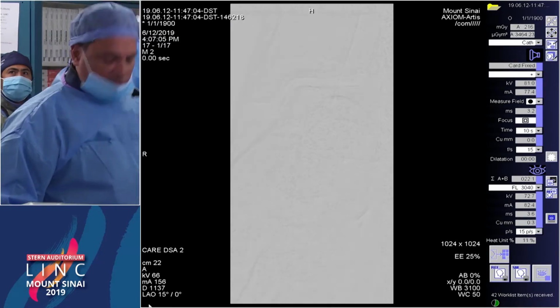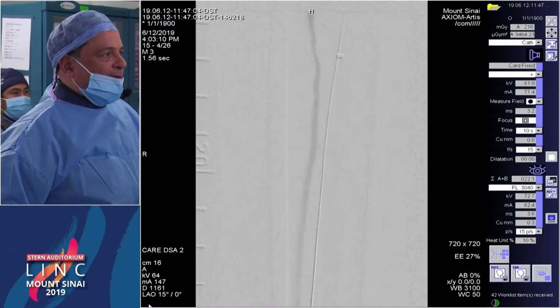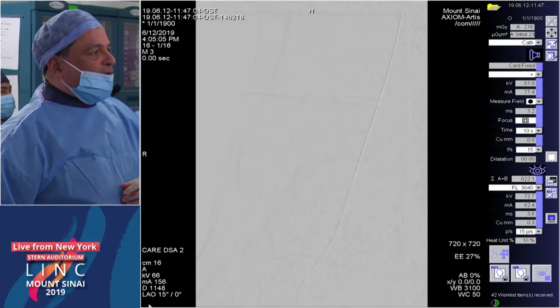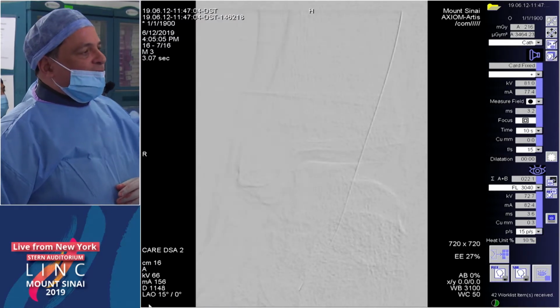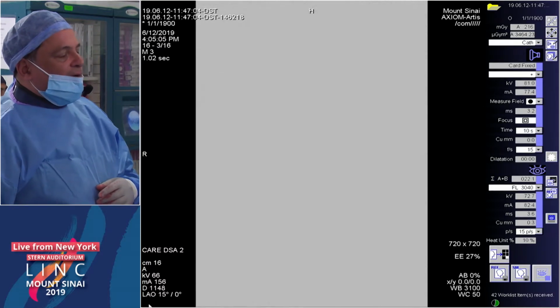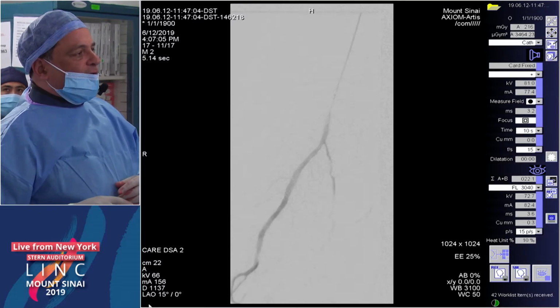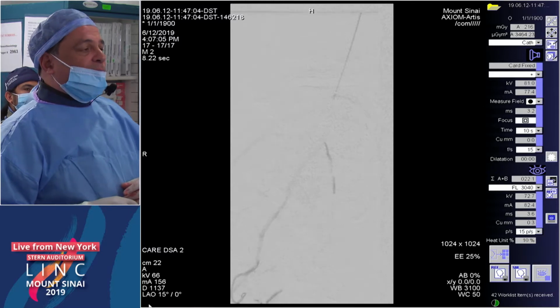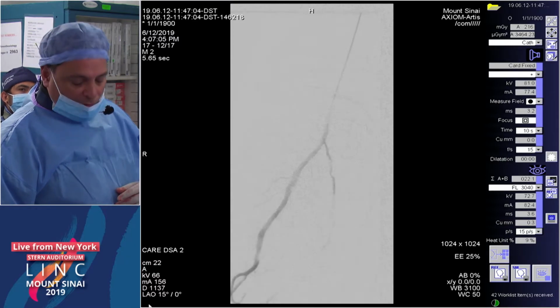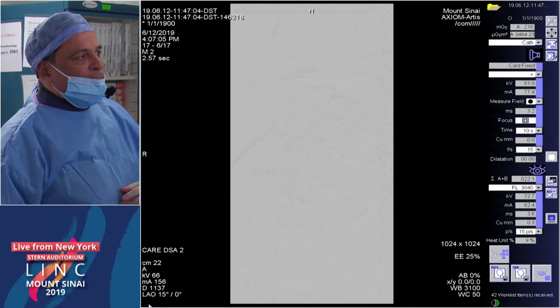So what we did was, when we were away, we went ahead with a Confianza wire like we talked about with Rob, and then I took the support catheter way down, and then I switched out to a Corsair, and was able to advance the Confianza wire all the way into the foot. As you can see, we're in the DP here. Then I took the Corsair and twisted it and made a circular motion, and was able to get all the way into the foot from above. As you can see, it's a good DP, and you're right, Fadi, we probably could have stuck it. It looked very diseased, but it wasn't that bad when we were in there. I'm sure ultrasound interrogation might have helped me more here, but I'm sort of like Chris Metzger, I don't do much of those usually. So now I'm here, and I've crossed.